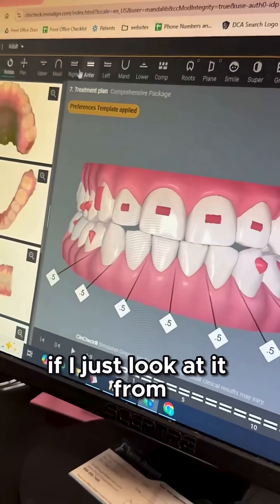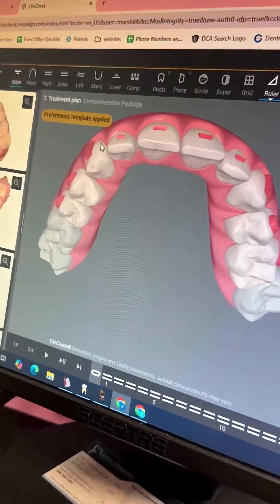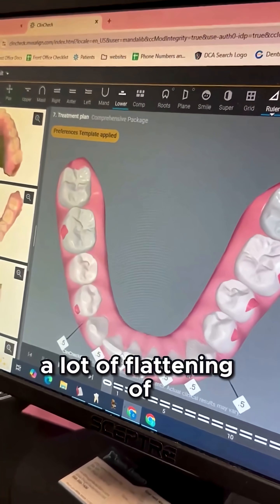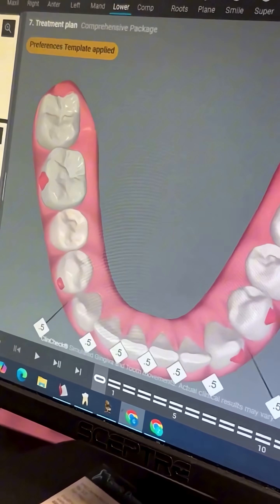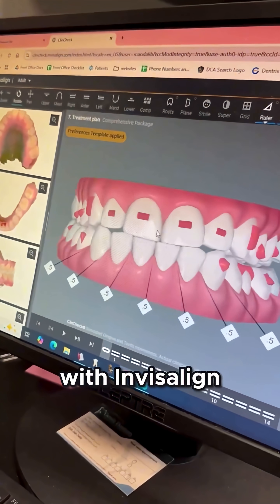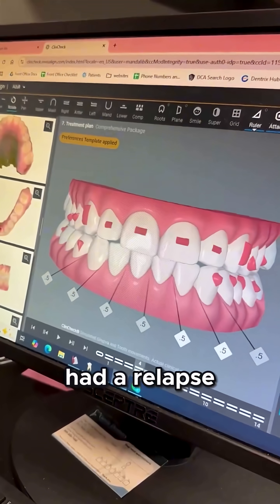If I just look at it from this point of view, there's a lot of flattening where it should be nice and rounded, and same with the bottom — a lot of flattening of the teeth there as well. So what we went through with Invisalign is to try to correct what wasn't corrected with traditional ortho — and it could have just had a relapse.